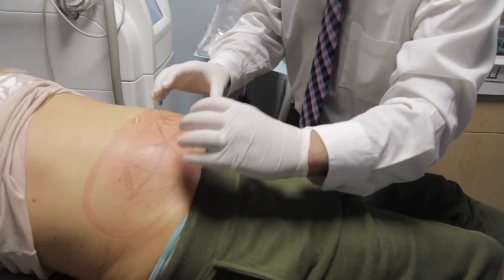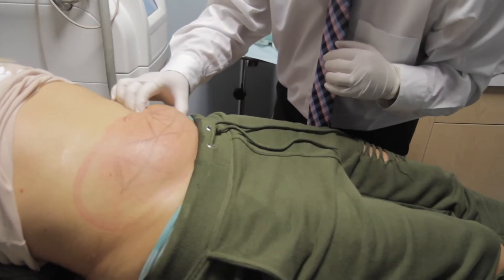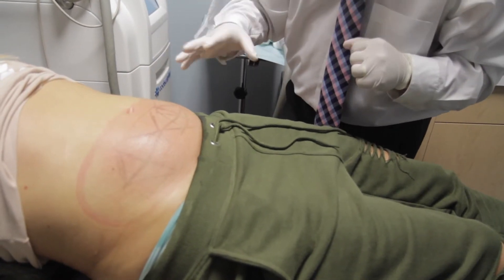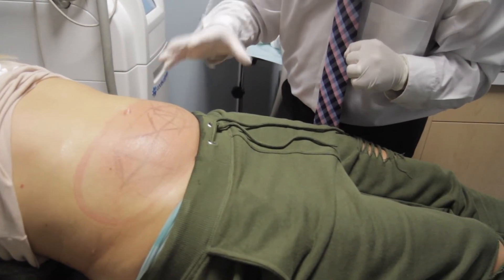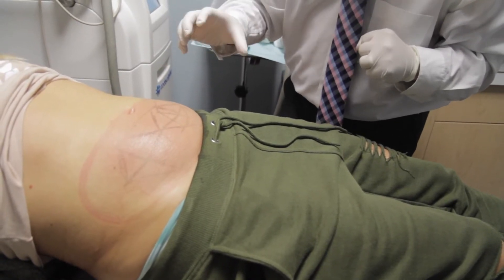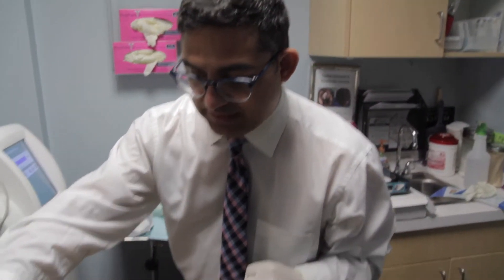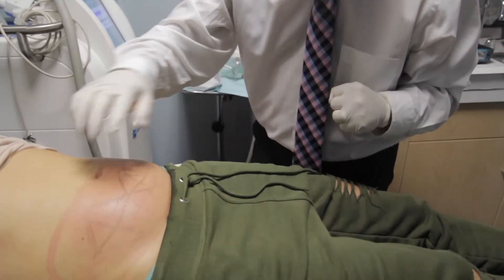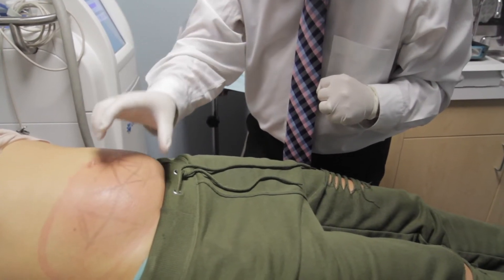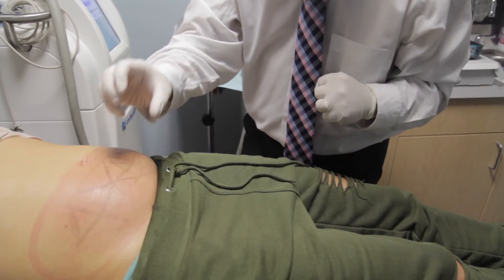We typically divide the lower part into two sections — one part right here and one part right here. I'm the one who does all the drawing, because I truly believe that when a doctor does the drawing, the results are better — you can apply the CoolSculpting directly in the area where you need it. The CoolSculpting goes in this area; I've already done the right side and it sucks in the fat, freezing the fat on the inside.